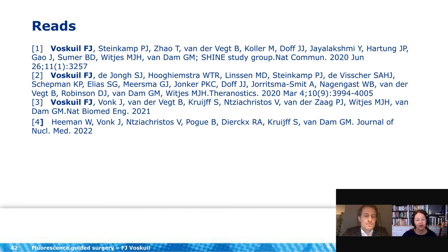Our first question is: is imaging limited to surface layers? Is it possible to work with deeper tissues? And if so, to what depth? Yeah, that's a really interesting question. Thanks for that. Yes, it is. The techniques we are using, imaging is possible a couple of millimeters into the tissue. It's reported up to 6 millimeters. I think that's a bit optimistic. I would say 2 to 3 millimeters, max 4.